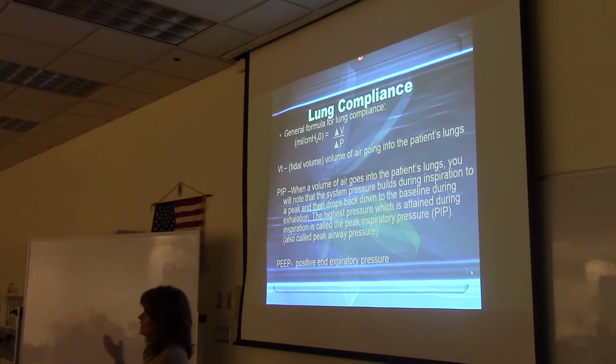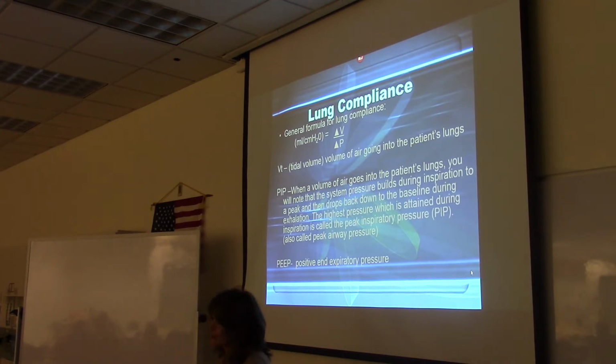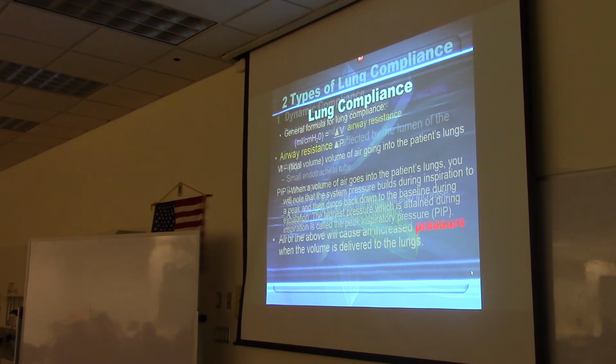So we can use the ventilator to not let go of all the patient's air, to hold some air in their lungs and keep that positive pressure in there even at the end of exhalation, and then we'll notice their oxygenation will improve. So that's what PEEP is. You don't have to write that because we'll come up to it in a bit. But you do need to know to subtract it in the formula.